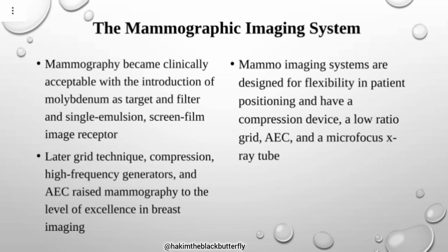The breast is always compressed. The breast is compressed during imaging. There are many advantages why the breast is compressed. We normally use high frequency generators. You remember our second lecture, which was about the X-ray generators. High frequency generators have many advantages over others.